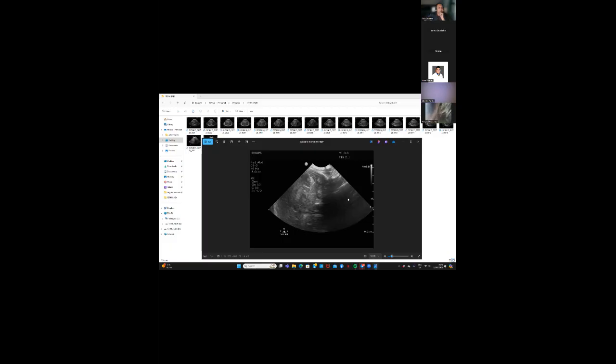I'll just annotate it for you. So it's a decent image of the right cerebellar hemisphere that you can see over here. That's the fourth ventricle that you see. Cisterna magna will come on this side. And it's not unusual in term babies. You've got a very small window. Because your window is so small, where the sutures fuse, it becomes quite challenging to be able to get the mastoid view. So you've definitely got the right.